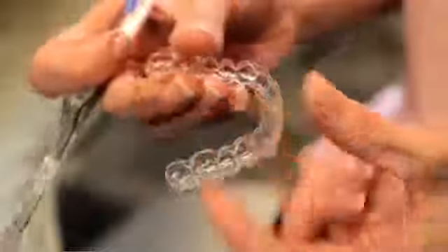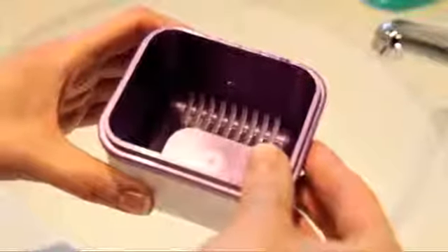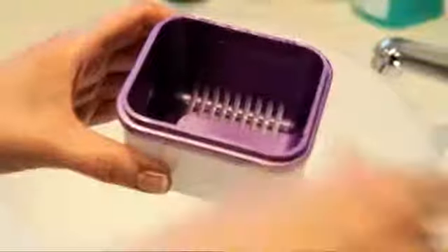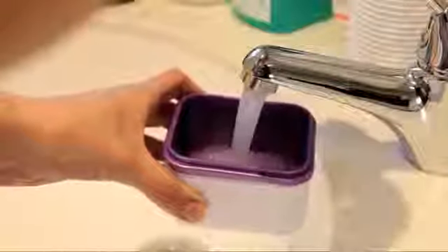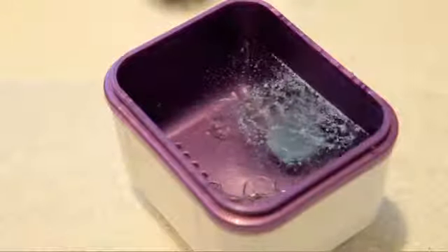For hygiene reasons, put the brace straight in the box when you take it out for eating. The aligner should be cleaned daily with a separate toothbrush to remove food debris and plaque. In your Vitus Orthodontic pack there is a special bar for cleansing your brace. Place your brace in the bath and add some lukewarm water, enough to cover the brace, and then introduce one of the effervescent cleansing tablets.